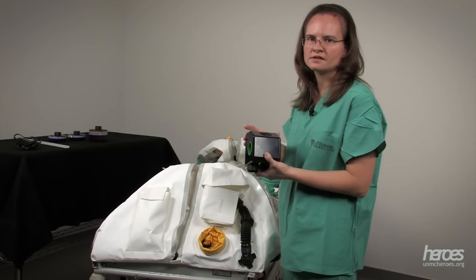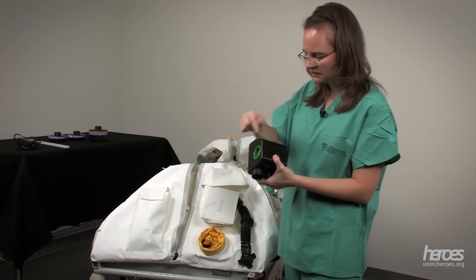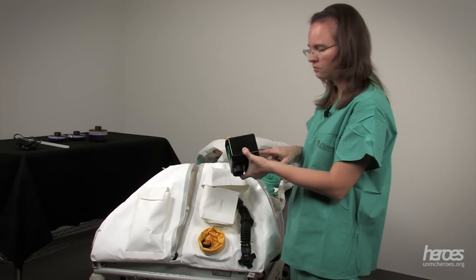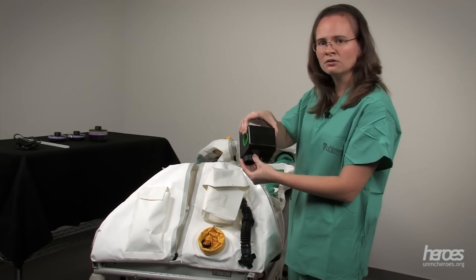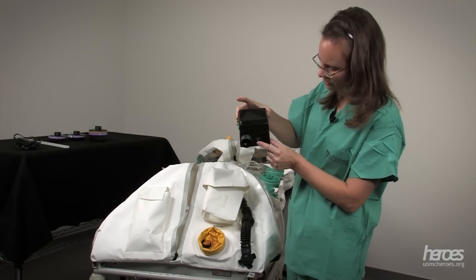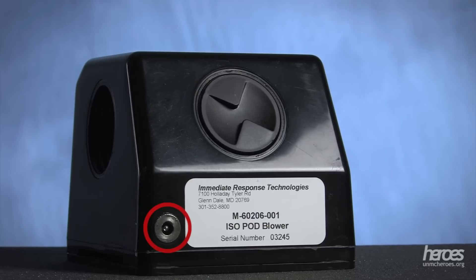The blower motor for this isopod is very similar to one that we would use for a powered air purifying respirator. There are three air inlets, two of which we're actually going to cap. The third one is where we're going to connect to the isopod using this hose and screw connector. The air outlet at the bottom is where the air will pass out having been filtered back into the environment. At the bottom you'll also see the power switch, and on top you'll notice a silver port to connect the battery charger.